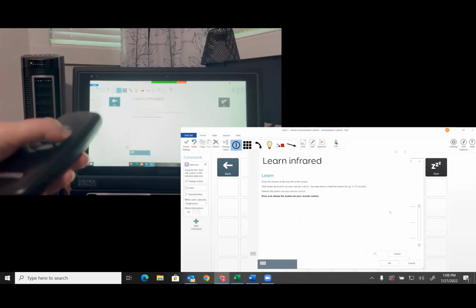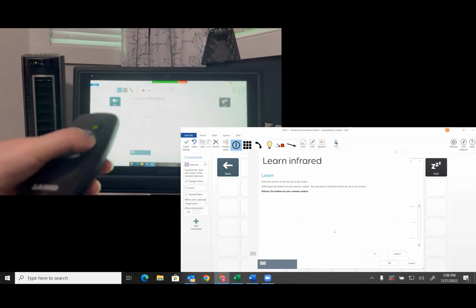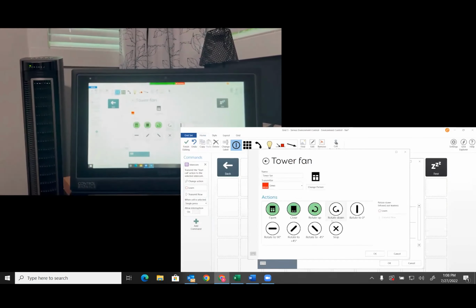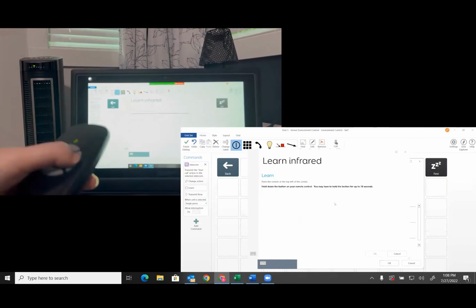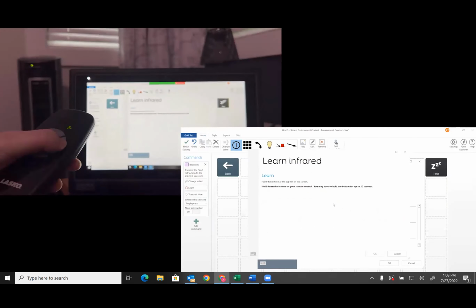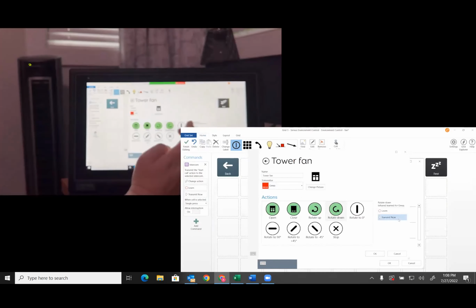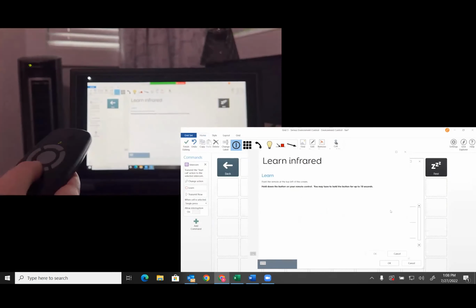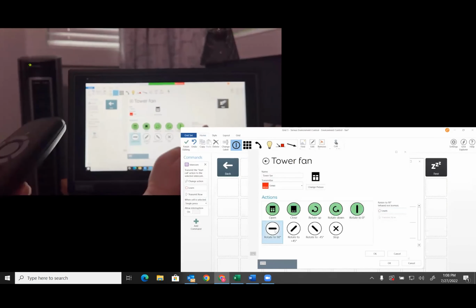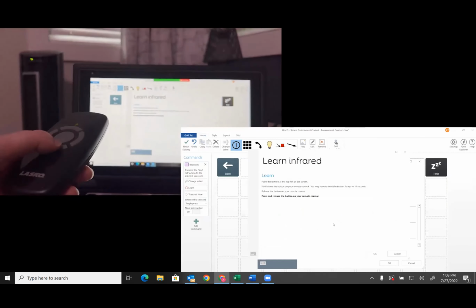It took a few attempts at trial and error to figure out which sequence to hit my buttons to get the command I wanted. In my case, if I wanted to program the power on command, I needed my fan on when I start learning so that the initial button turns it back off and the sequence of button hits following that picks up on the on command. It just takes patience, trial and error, and outsmarting the technology. But that's the nature of IR technology.